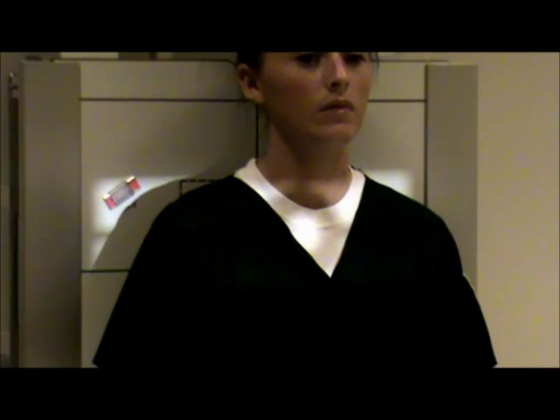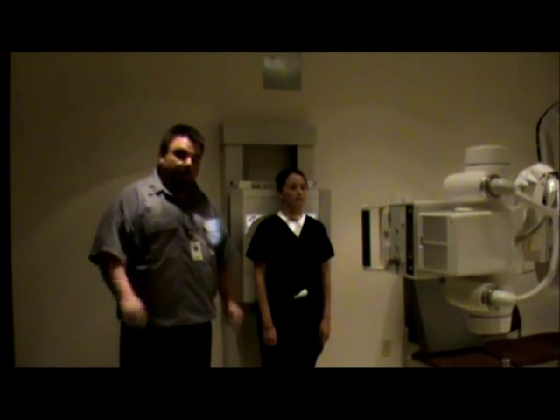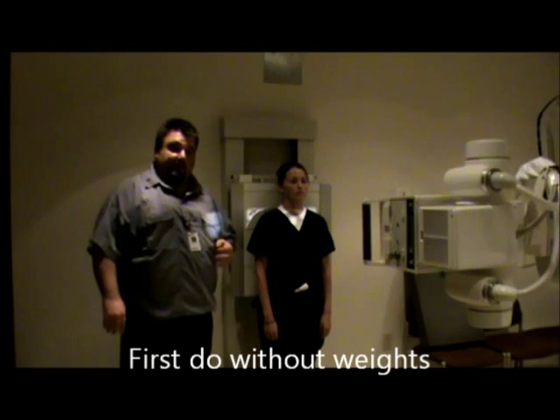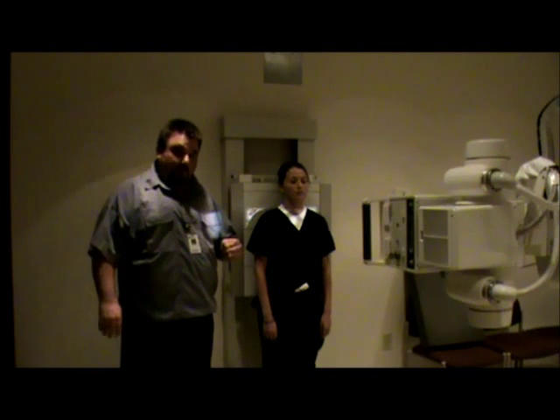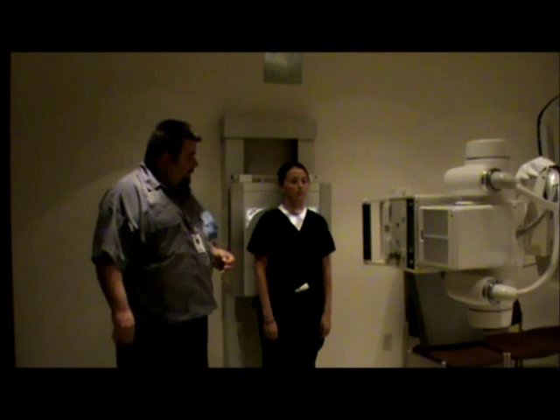We want to make sure we get from all the way out to the AC joints, and then tight going in and out, up and down. Center to our film. We're doing this without weights. After we make this exposure here, we do want to go to the radiologist. Let the radiologist look at this film to make sure there are no obvious fractures or any problems before we actually give the patient weights to hold in their arms, because it could cause further problems.